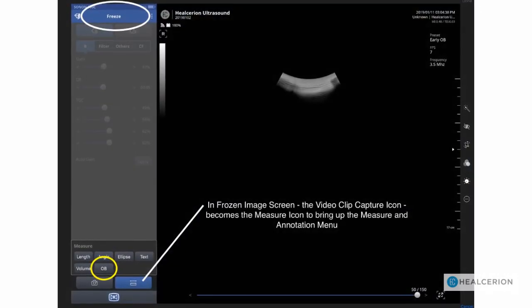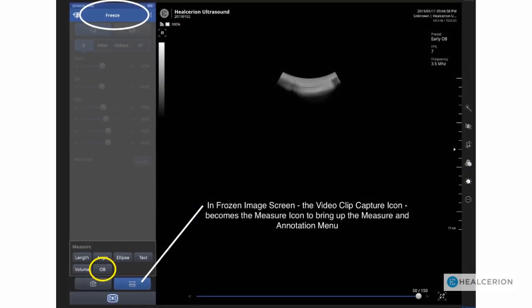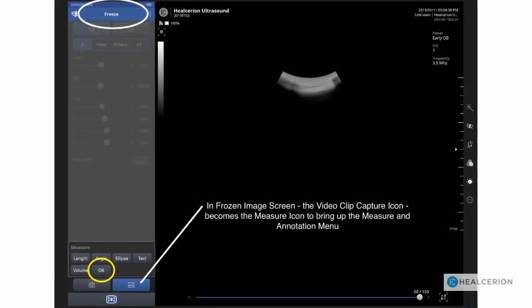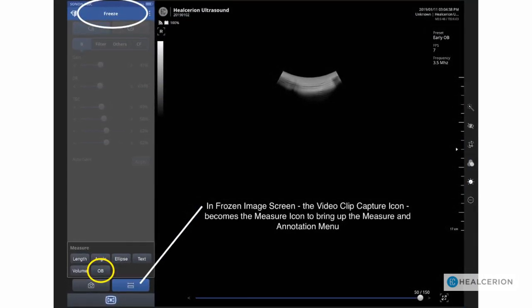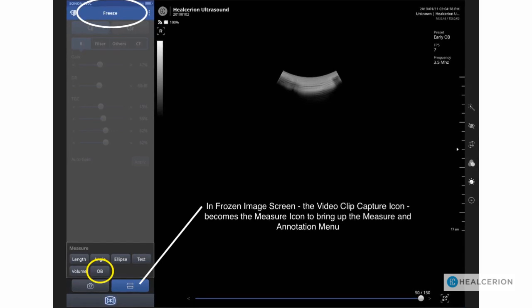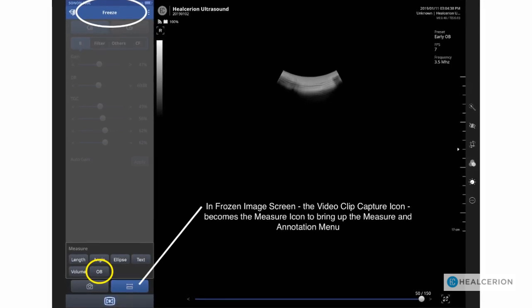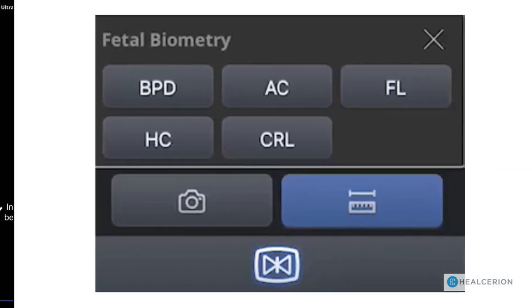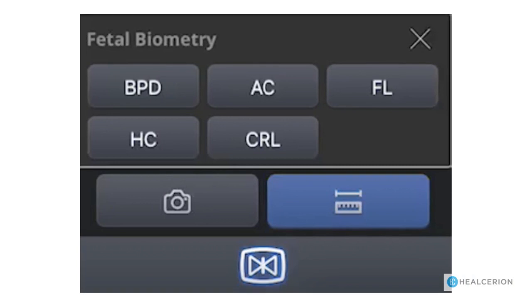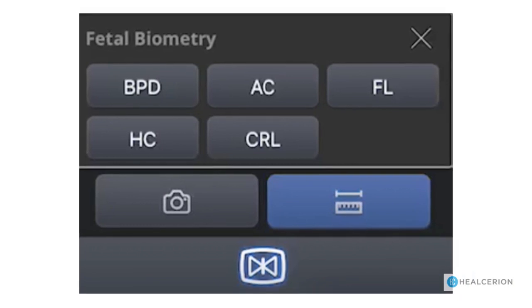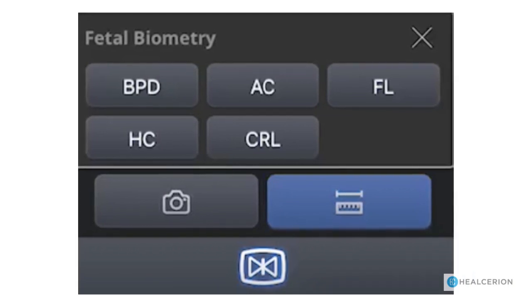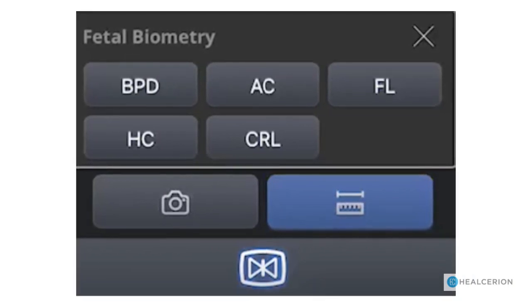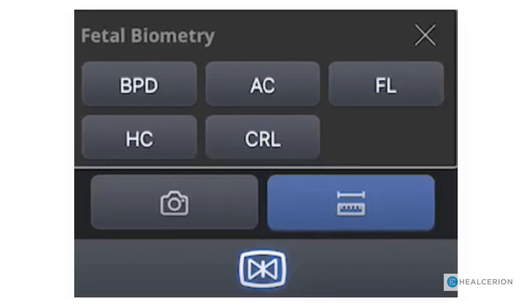While scanning, once the image is frozen, the video clip icon now becomes the measurement menu icon. Pressing this will bring up the menu. Choosing the OB tab from the measurement menu will bring up the fetal biometry menu.